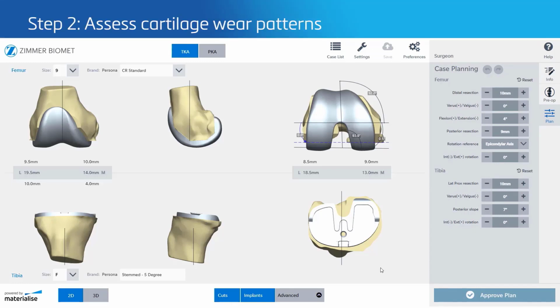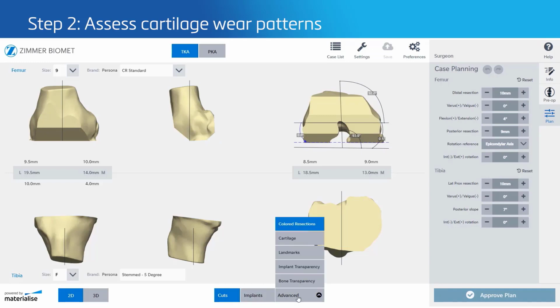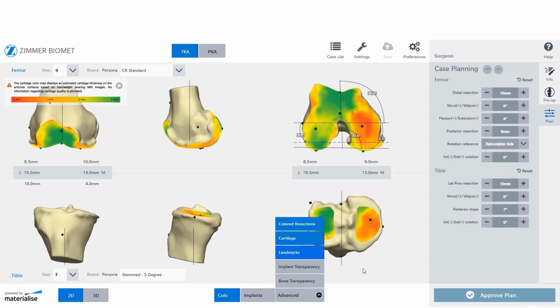Now you can deactivate the implants and activate cartilage and landmarks. The cartilage color map provides insight into the cartilage wear patterns on the articulating surfaces for each patient. Assess cartilage wear at the location of the distal and posterior landmarks of the femur and at the proximal landmarks of the tibia. The amount of cartilage wear can be considered when adjusting alignment and resection levels in the next steps.